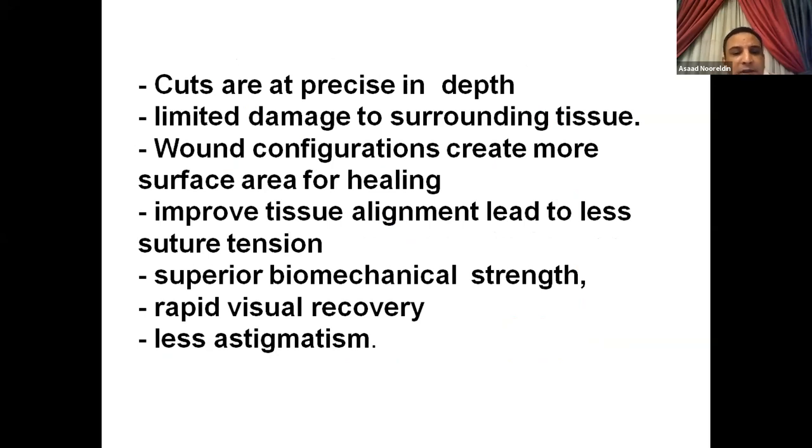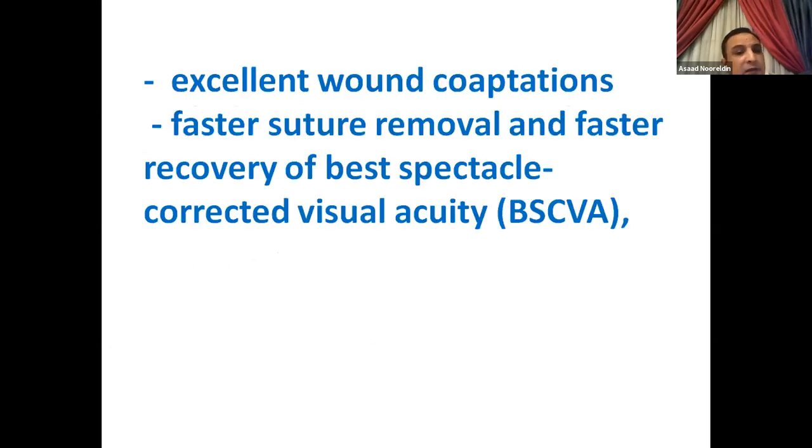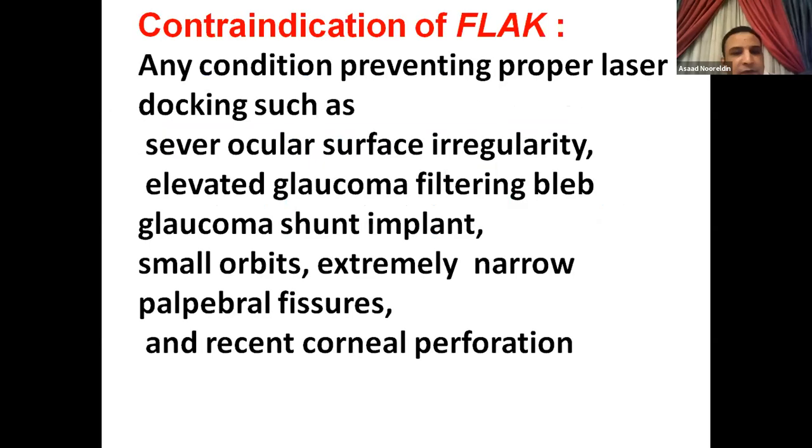The wound configuration creates more surface area for healing and improves tissue alignment, which leads to less suture tension, superior biomechanical strength, rapid visual recovery, and less astigmatism, excellent wound coaptation, faster suture removal, and faster recovery of the best corrected visual acuity. All these are the advantages of femtosecond laser assisted keratoplasty.